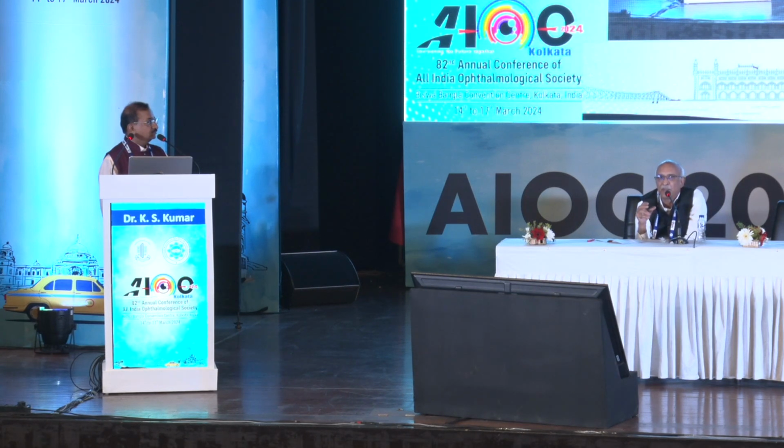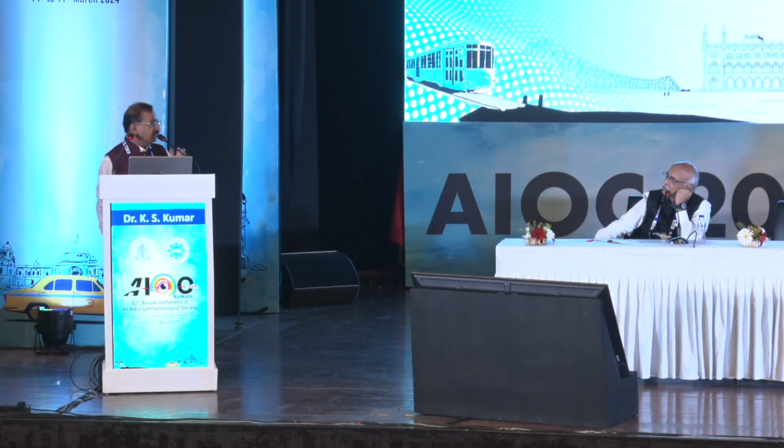If it is not coming because of the sheer shape of the foreign body, then we can do a retinectomy, do all that is required to prevent a retinal detachment from inside, and then go out to remove it from outside. The other thing I wanted to ask was, if it is totally beyond the eye and there is no evidence of any intraocular damage, we just leave it alone. So we should never go after the foreign body.